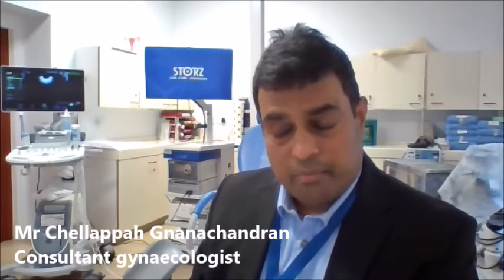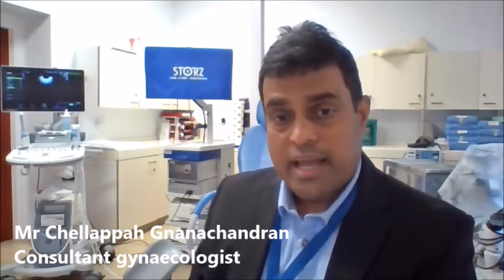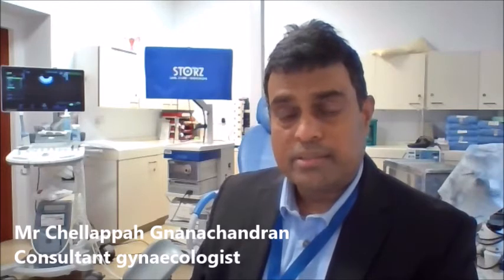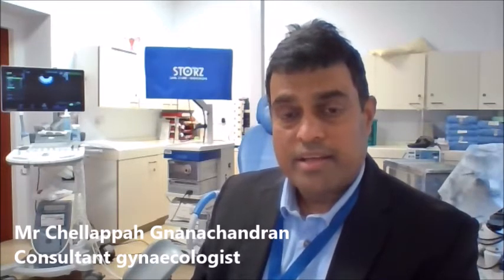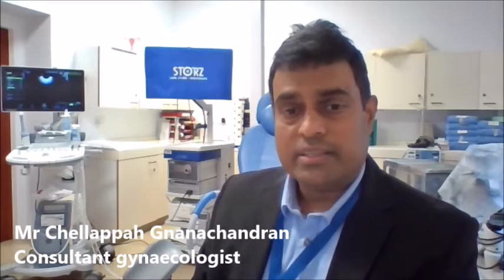Also, people like me who are scanning patients with endometriosis use the scan to assess pelvic pain, where the pain is, rather than using a digital vaginal examination or speculum. So you'd be avoiding a vaginal examination, which is much, much more painful.